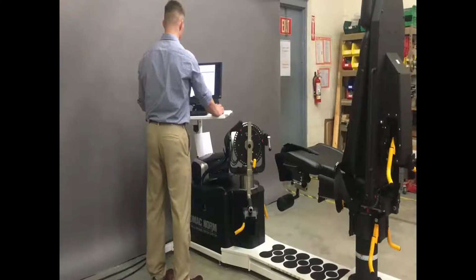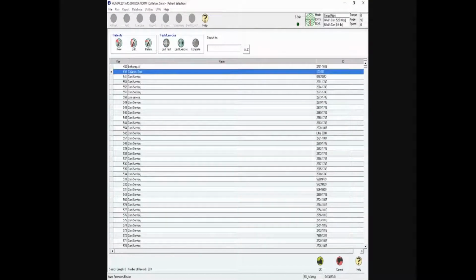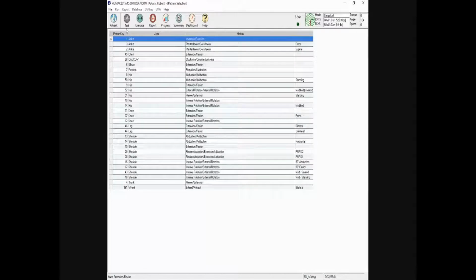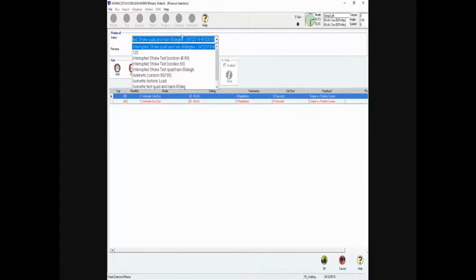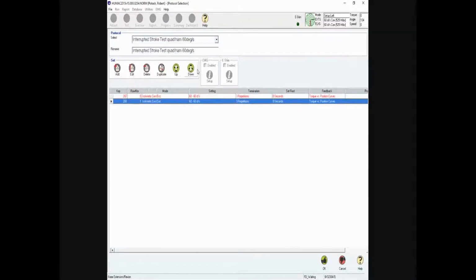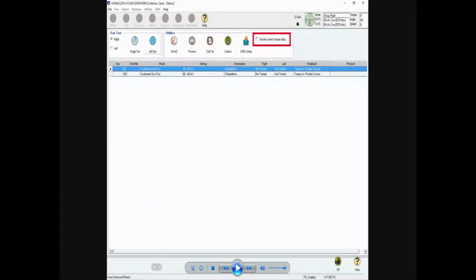In this video, I'm going to show you an interrupted stroke test for bilateral quadricep and hamstrings. First, select your patient from the patient menu, then click Test, select the joint and position, and then the protocol, and then click OK. You're going to get a warning of high torque, high speed. Just go ahead and click OK for that. Now when filming this video, sometimes my mouse pointer disappears, so I'm going to highlight what I want you to click on in that case. Click on Gravity Correct Torque Data, and then click on All Sets.